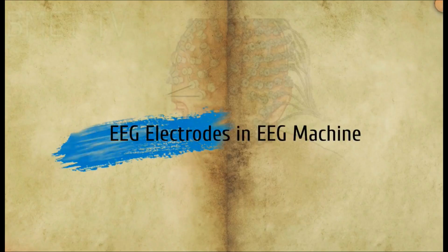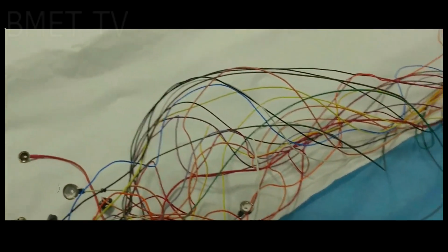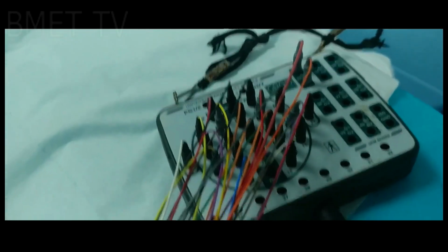Third is EEG electrodes in EEG machines. An EEG tracks and records brainwave patterns. Small metal discs with thin wires, electrodes, are placed on the scalp and then send signals to a computer to record the results. Normal electrical activity in the brain makes a recognizable pattern.